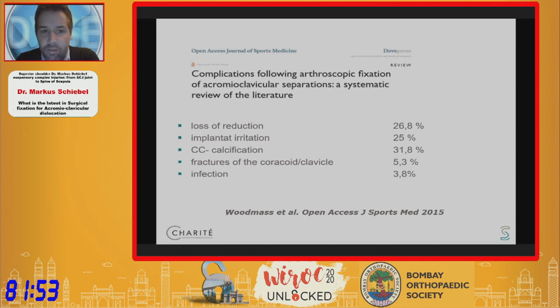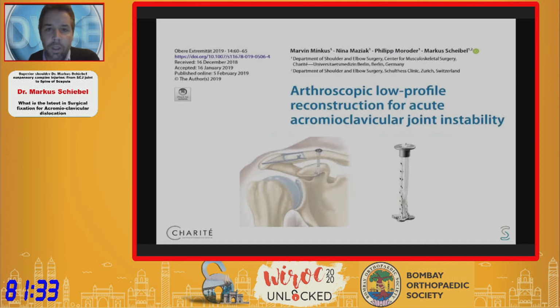Calcification, I don't think that's a true complication, but of course, fractures of the clavicle or the coracoid, if you have 2 drill holes, can be a problem. So the goal in the future needs to be to reduce these potential complications and obviously keep the good results that we achieved with the current fixation techniques.